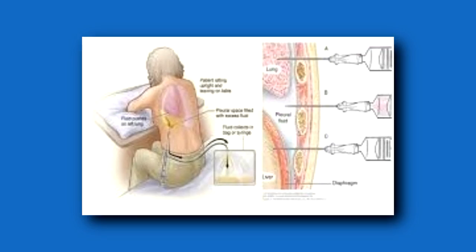All right, so thoracentesis can be performed for diagnostic and therapeutic purposes, or both. That's when a needle is placed in between the ribs from the posterior side of the body to access the fluid, usually under ultrasound guidance. This fluid can be used to alleviate symptoms, and the fluid can also be sent to pathology to test for cytology, chemistry, and culture.